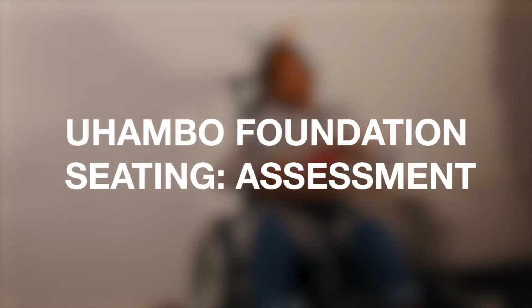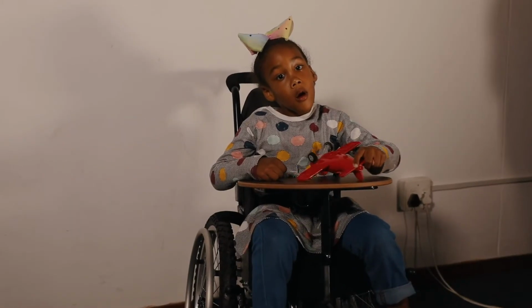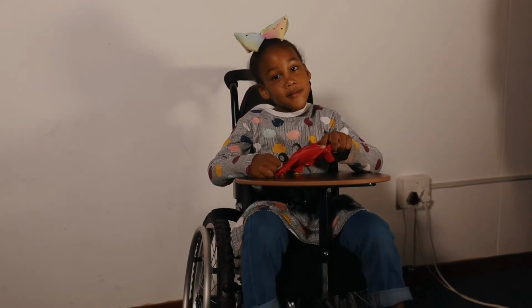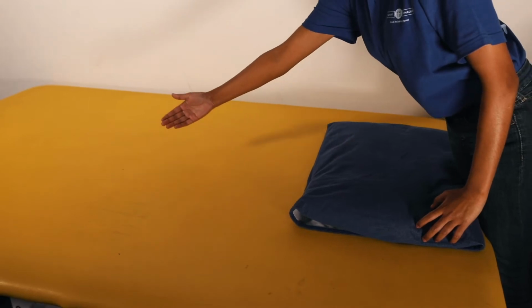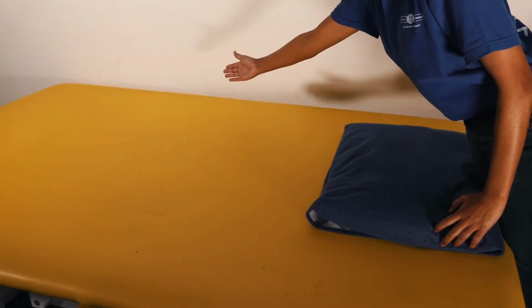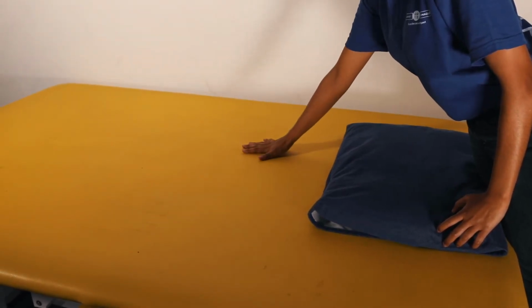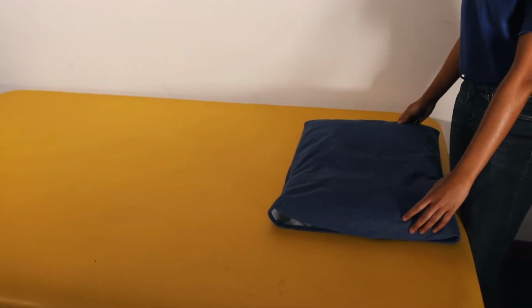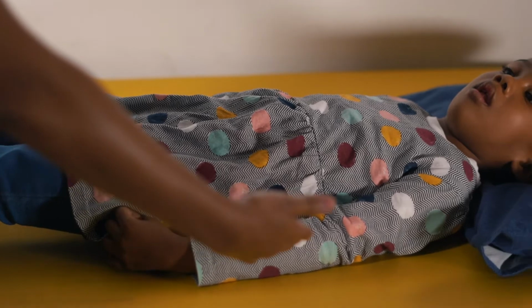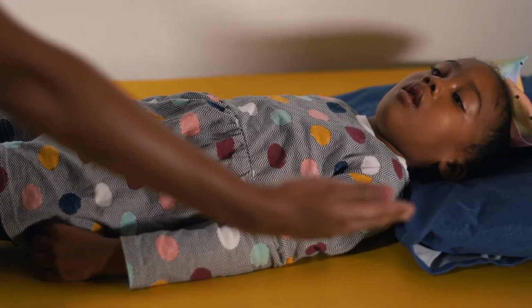When done correctly, measurement for a posture device makes for a better life for those living with disability. When we assess the client's ranges for sitting, we have to make sure that we use a firm surface for the client to lie on, so that we don't experience any trick movements of the body. Have the client in supine lying with a pillow underneath their head to support their neck.